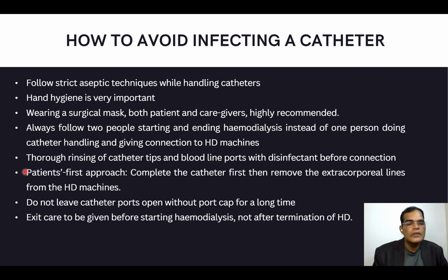We need to first take care of the catheter. The extracorporeal set anyway we are going to discard. We need not give much attention to it rather than giving attention to the catheter and the patient. Then again, don't leave the catheter ports after disconnection exposed for a longer time. This also can cause infection. Exit care, as I said before, should be given before commencing dialysis, not after the dialysis.